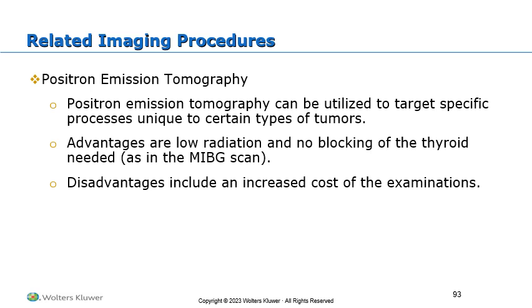And then we have positron emission tomography. This is a similar approach where we can actually look for metabolic changes within imaging that looks something like a CT. So it is a kind of combination of nuclear medicine and CT. So we get the soft tissue information from CT, but the nuclear medicine information about metabolism. So this is excellent in looking to see if metastasis has spread and things like that. These are expensive, they're less available, they're going to require the injection of those radionuclides oftentimes, and so they have a high cost and can be challenging that way.